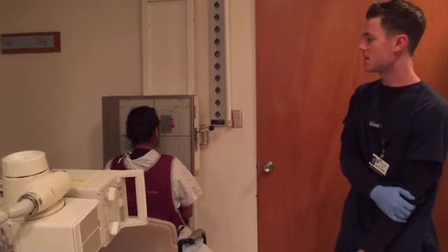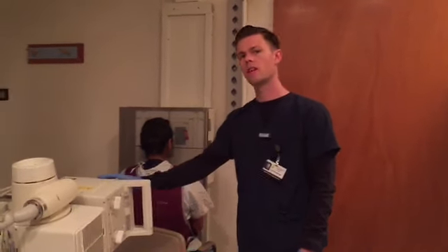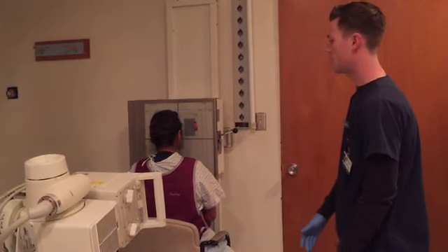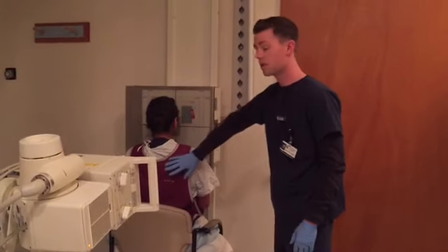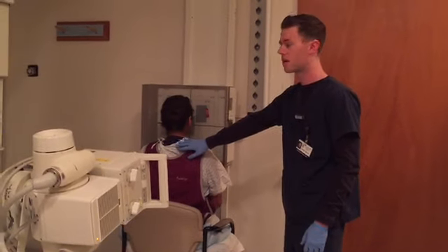Okay, now that we're done with the sinus series, I want to mention you would want to use a cone if you have one. We don't have one available to us, but it improves the quality of the image. So now we're going to move on to the mandible. We're going to be doing a PA axial to start. So we've turned the patient around, we've placed the shield back so that it's on her back. I've removed the thyroid shield because it's going to get in the way of the mandible.